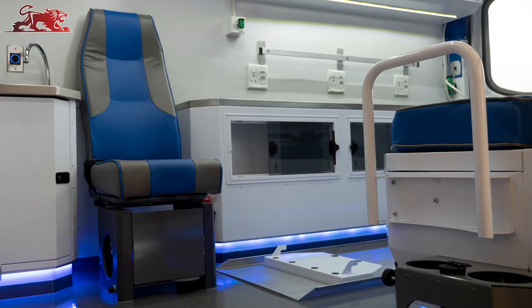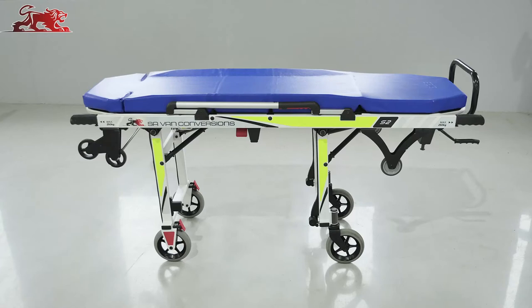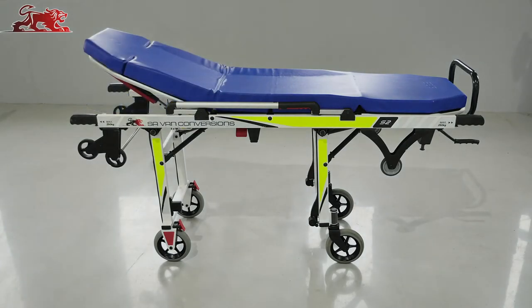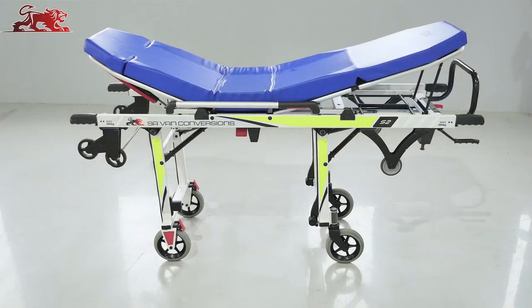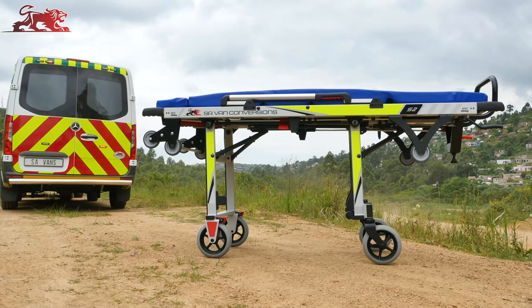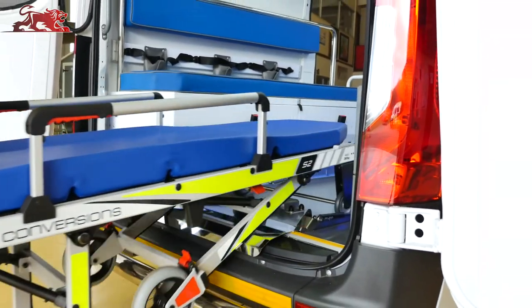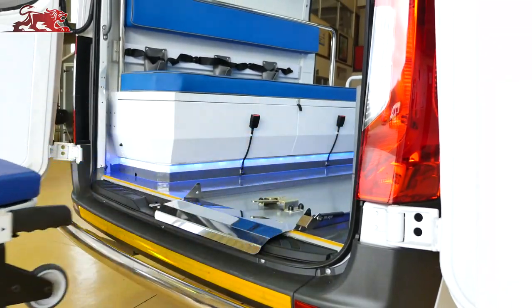A dedicated attendant seat with SABS safety belts and retractable waistband. SAVAN's manufactured S2 monoblock aluminium self-loading stretcher with adjustable back and footrests and 200mm wheels, making this the ultimate lightweight yet robust all-terrain stretcher. The stretcher loads onto an all stainless steel body fluids tray with a self-locking restraint system.